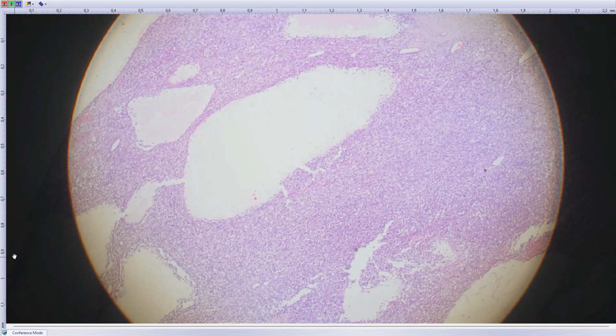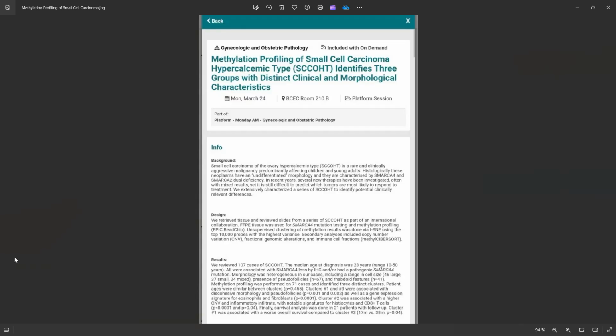So what did you say? SMARCA4 lost, accompanied by SMARCA4 mutation of germinal origin. And I would ask Patrik for the picture. As I said, very rarely you can see even mucinous glands there. We have over 20, 30 cases of it, but we don't have a single case with mucinous glands. Yeah, there were no mucinous glands as well.